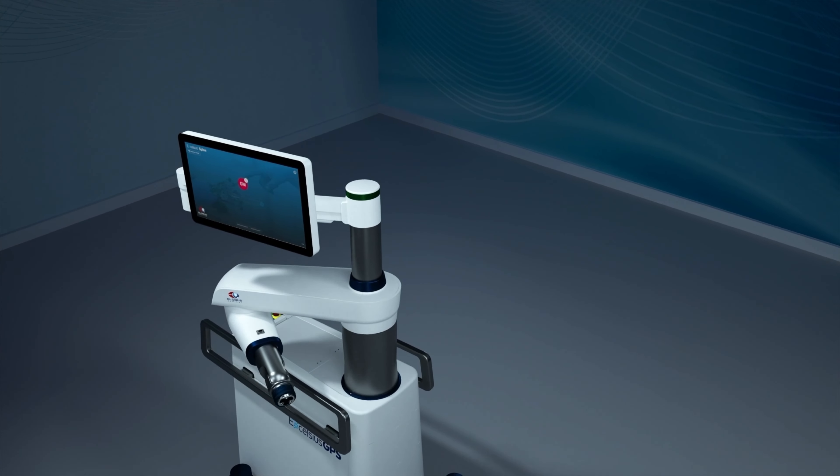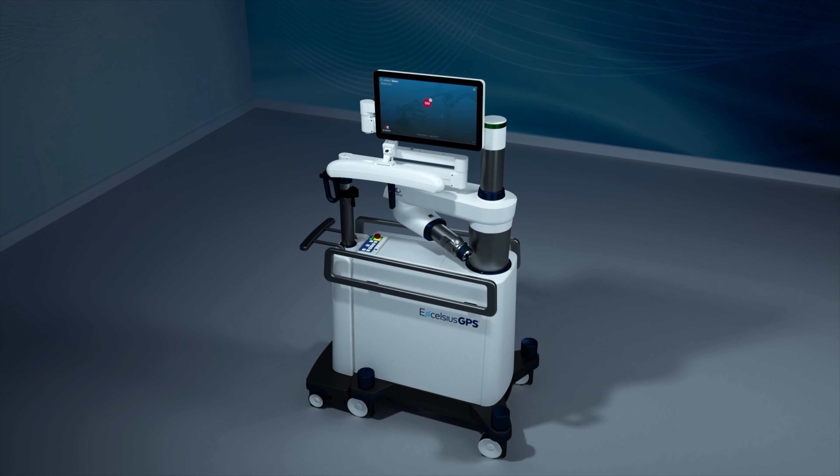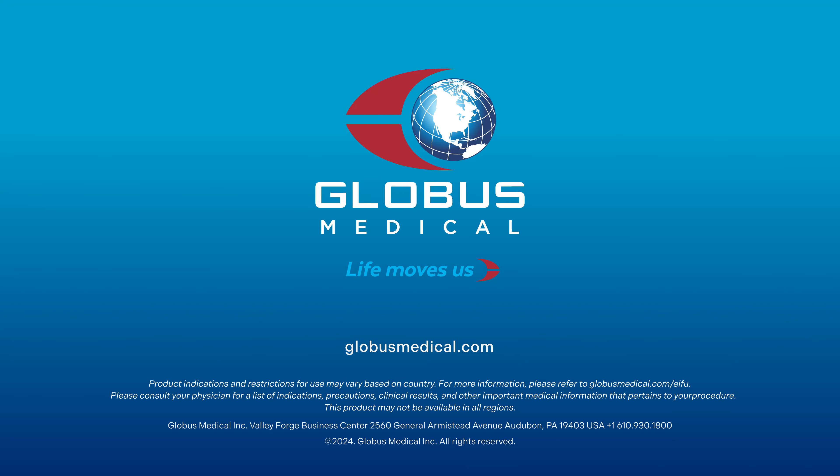After the case, the camera docks into the robotic base station, making it easy to move as one mobile unit between operating rooms, or for compact, easy storage. For additional information about the Excelsius GPS robotic navigation platform, visit www.excelsius-gps.com.